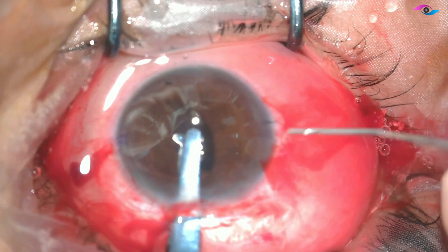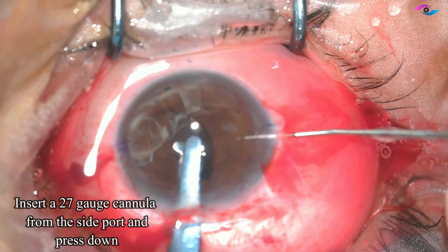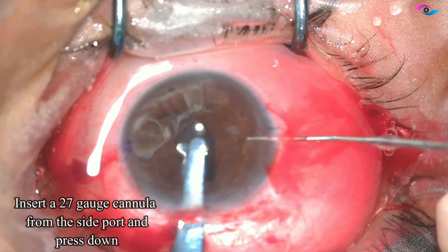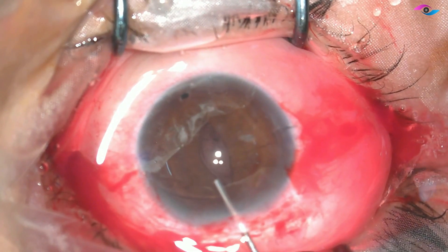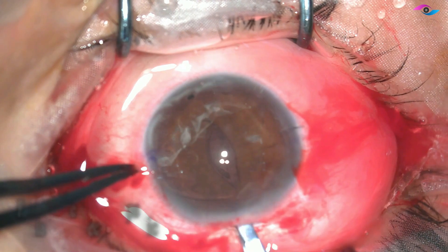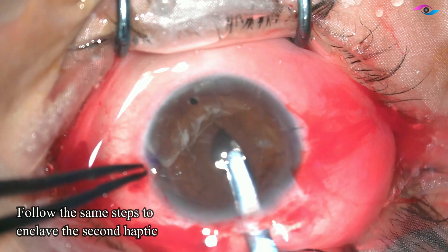This also helps in knowing where the enclavation needs to take place and where the claw of this lens is. Now I am using a 27-gauge cannula, injecting it from the side port and pressing it down to enclave it very nicely. We can also pull the IOL before coming out to make sure that the enclavation is good.